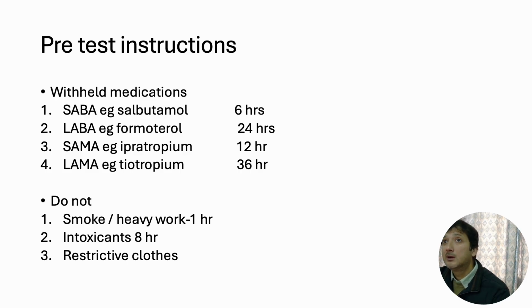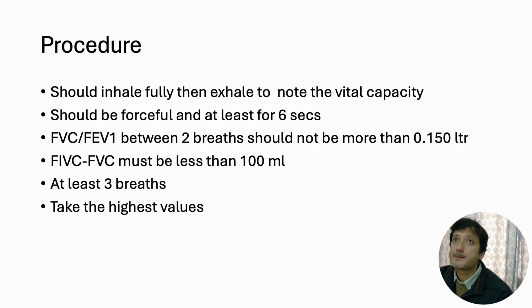We should also ask the patient not to smoke or use vape or shisha, or even do heavy work, within 1 hour before the test. The patient should not use any intoxicants like alcohol for 8 hours, and should wear comfortable clothes; restrictive clothes should be avoided.